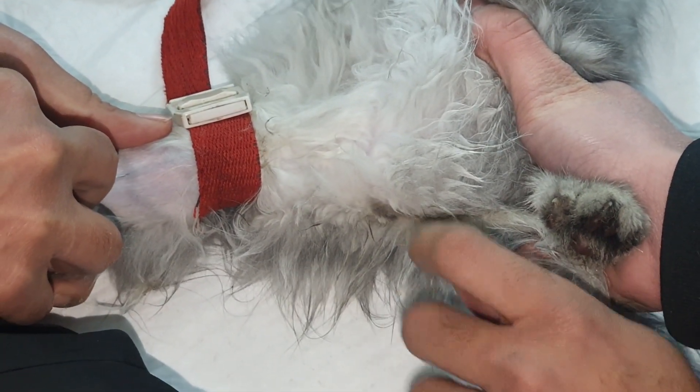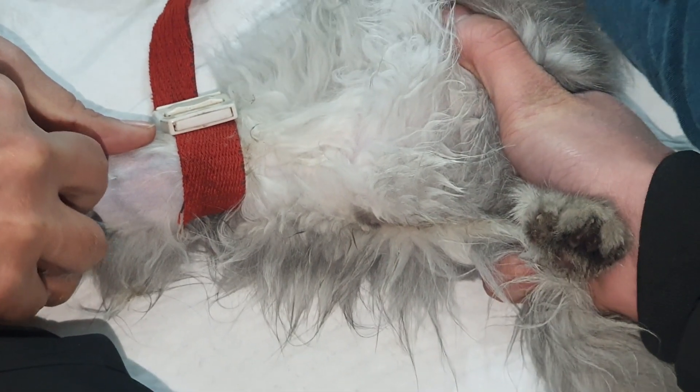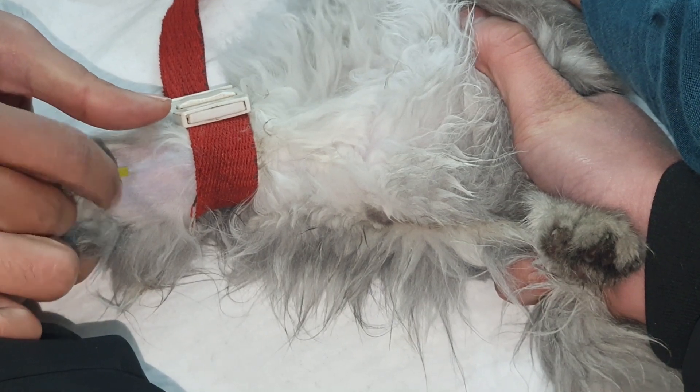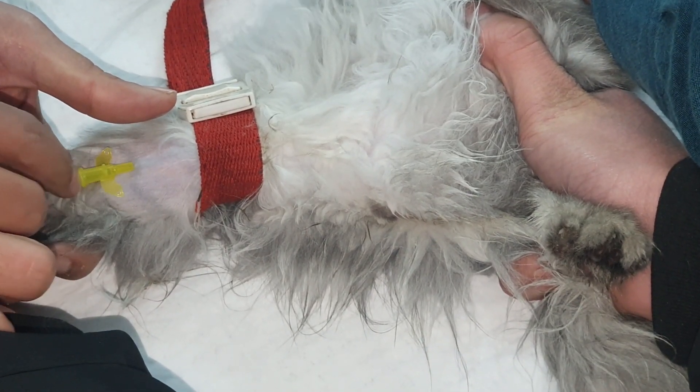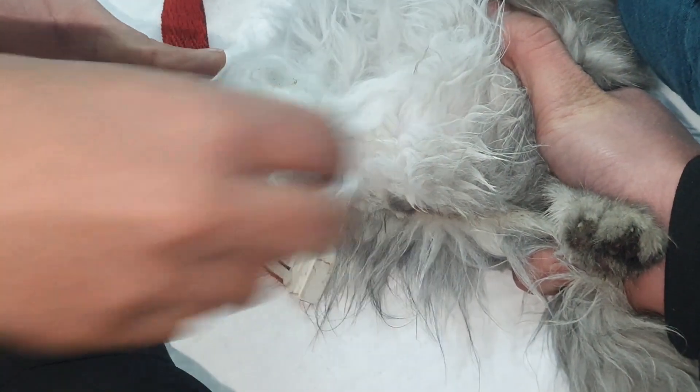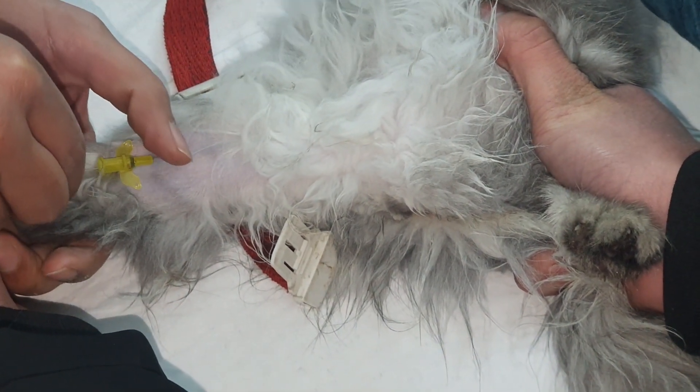Then we will place the branula inside the vein very gently, and after this we will simply pull out the needle to see if the blood is coming. As you can see in the video, the blood is returning, which means that our branula is placed correctly right in the vein.